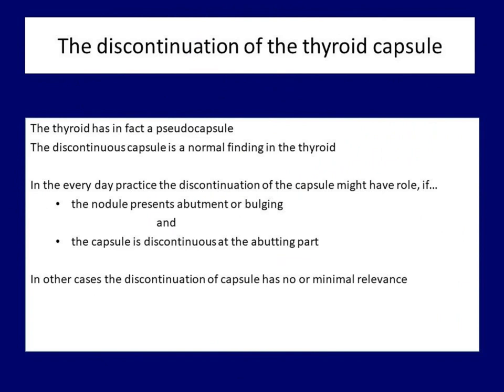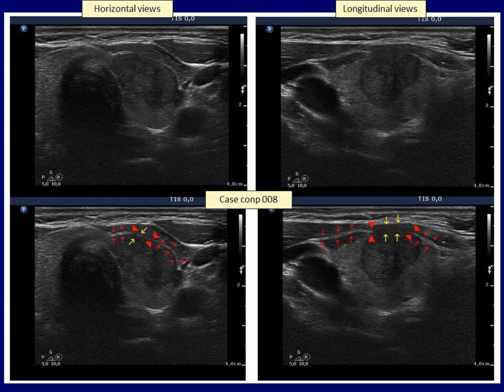Let's see first the thyroid capsule. Unfortunately, the thyroid does not have a real capsule, only a pseudo-capsule. The outer layer of this pseudo-capsule does not cover the entire thyroid gland — it only connects the thyroid to other organs of the neck. Consequently, a discontinuous pseudo-capsule is a normal finding. Extrathyroidal spread can be raised if the capsule is discontinuous and the contour is abutting. The discontinuation has no relevance if the nodule is covered by normal tissue. The capsule, an echogenic line, is pointed with red arrows and is discontinuous between red arrowheads. In deeply hypoechoic nodules, the echogenicity of the nodule is identical to that of the strap muscle — see yellow arrows.